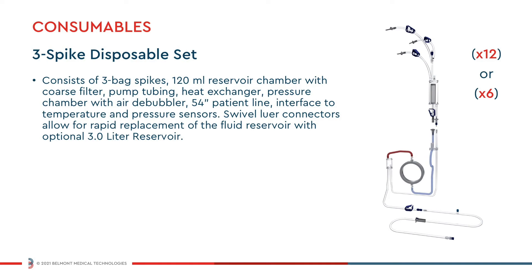The Belmont 3-spike disposable set contains everything you need for a procedure and is the only consumable required to operate the rapid infuser at its full range of flow rates. The disposable set consists of 3 bag spikes, a heat exchanger, a 54-inch patient line, and a 120 milliliter coarse blood filter reservoir. Quick connections below the reservoir allow for easy and rapid replacement with the optional 3-liter reservoir.